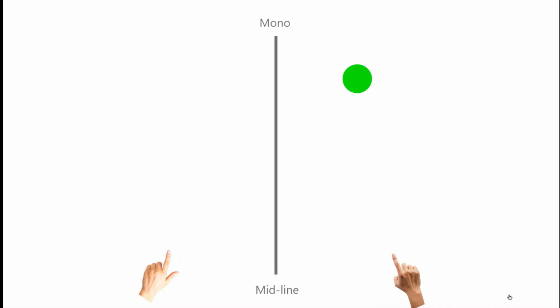Variations may be added to this. If you have a stroke patient who has a lot of difficulty with motor movements of one hand, you can have him just use that. And one time he'll cross and the next time not cross the midline. You need to know your patients, of course, and a lot of times we start with one but end up with a midline cross because that is the most difficult of the techniques.